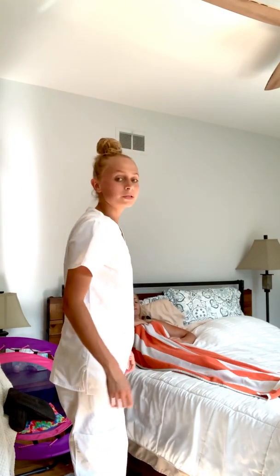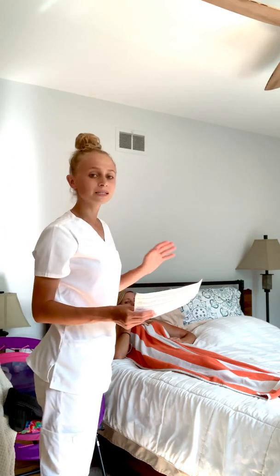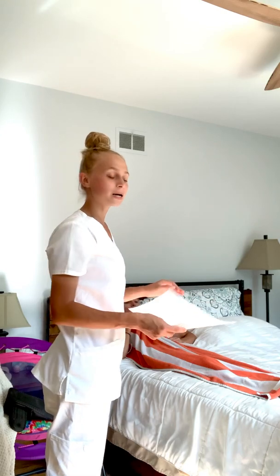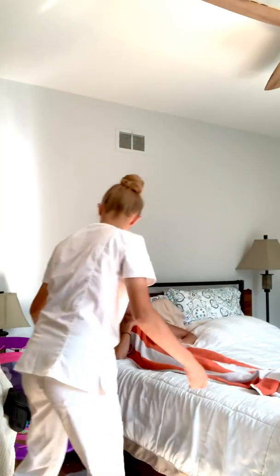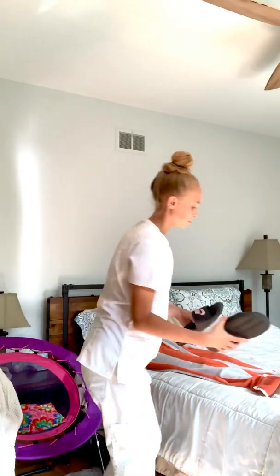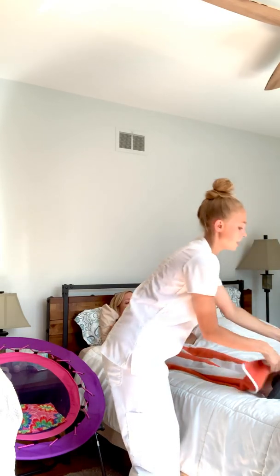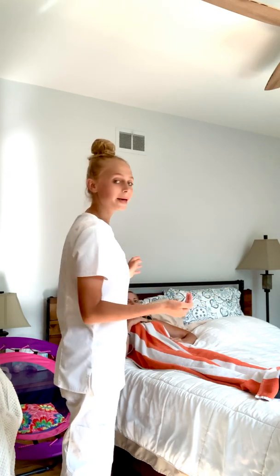And now I'm going to take the paper, and I'm going to be placing this underneath her feet, and this is going to act as a barrier when I put the non-skid footwear on her. So now I am going to be putting on the non-skid footwear. And now I am going to help position my patient onto the side of the bed.